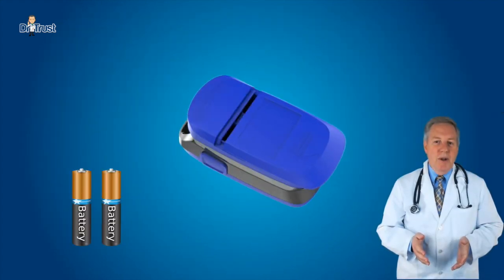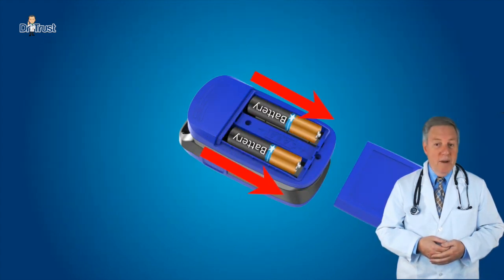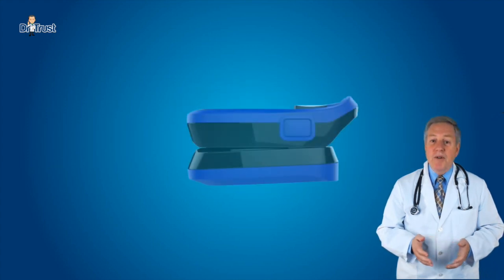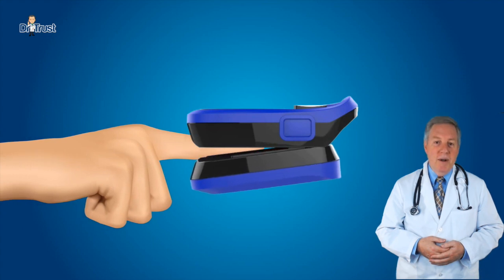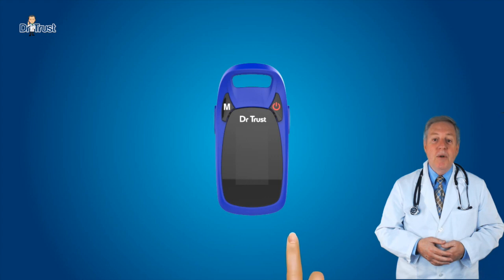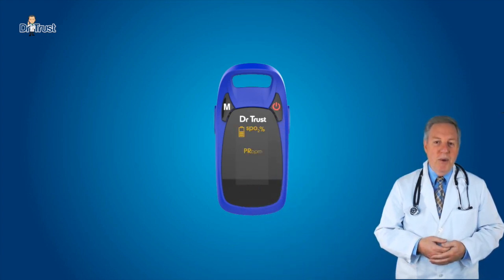Starting the product is easy. Simply insert two AAA batteries in the correct polarity and put the cover on it. Put one of the fingertips into the rubber hole of the oximeter with the nail surface upwards and release the clamp. Press the power button for two seconds to turn the pulse oximeter on. Read the corresponding data from the display screen.